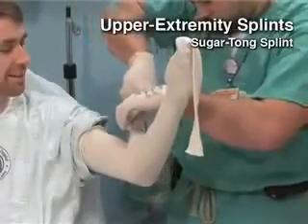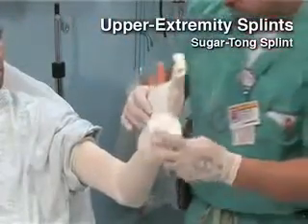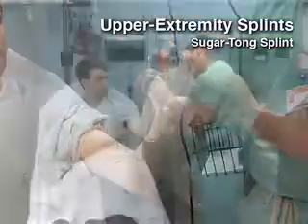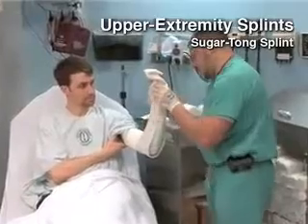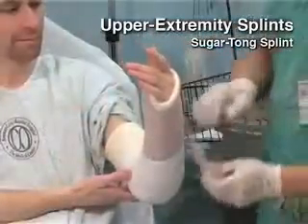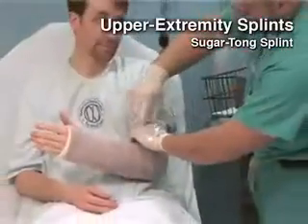A forearm sugar tong splint is used for wrist and distal forearm fractures. It immobilizes the wrist and forearm and prevents supination and pronation of the forearm. The splint extends from the metacarpal phalangeal joints on the dorsum of the hand, along the forearm, around the elbow, and back to the volar aspect of the mid-palmar crease. Place the elbow in 90 degrees of flexion while maintaining a neutral position for the forearm and wrist.